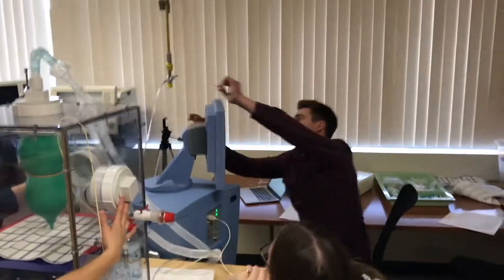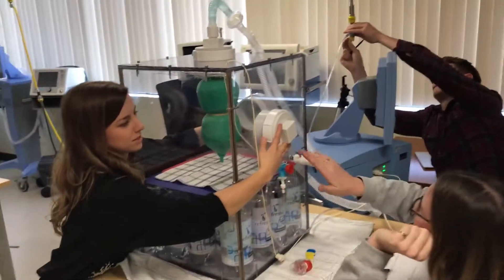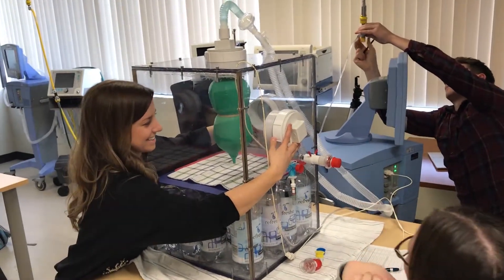Cover. Flush that bad boy. And watch this here. Sierra, maybe scoot back a little bit — you kind of pop out.